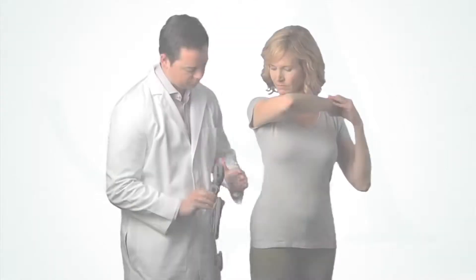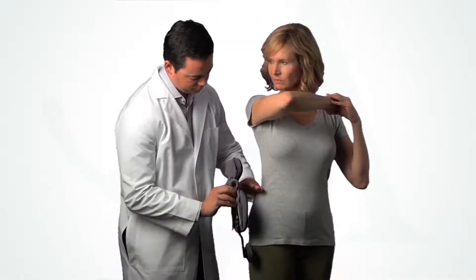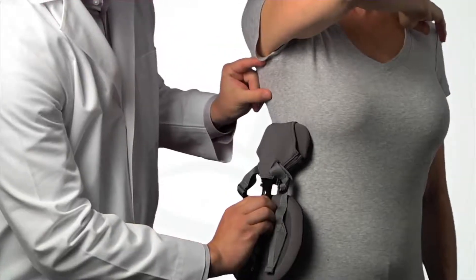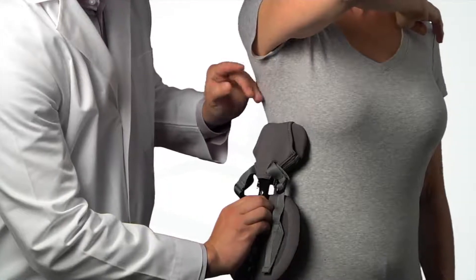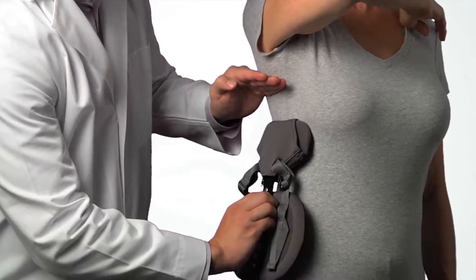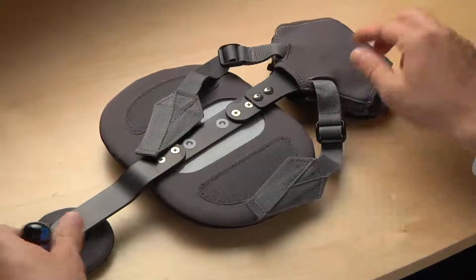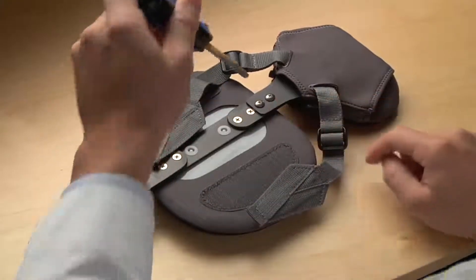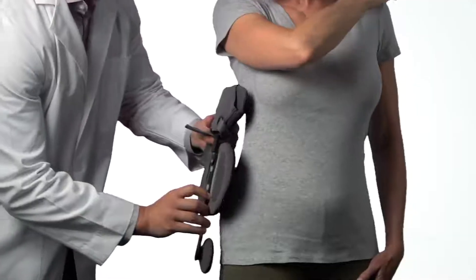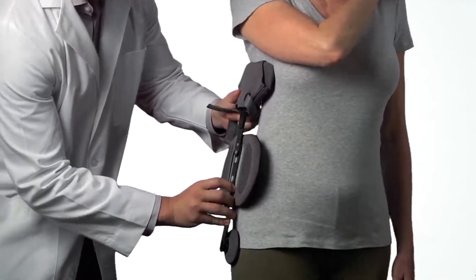To apply, first determine which side of the patient should be supported — for this video, it will be the side with the lower shoulder. Place the universal strut assembly against the patient with the iliac pad just above the iliac crest. The thoracic pad should be approximately two inches beneath the patient's underarm to avoid discomfort when seated. To increase the height, use a Phillips screwdriver to remove the two screws that secure it, then position the thoracic pad as needed and reinstall the screws.